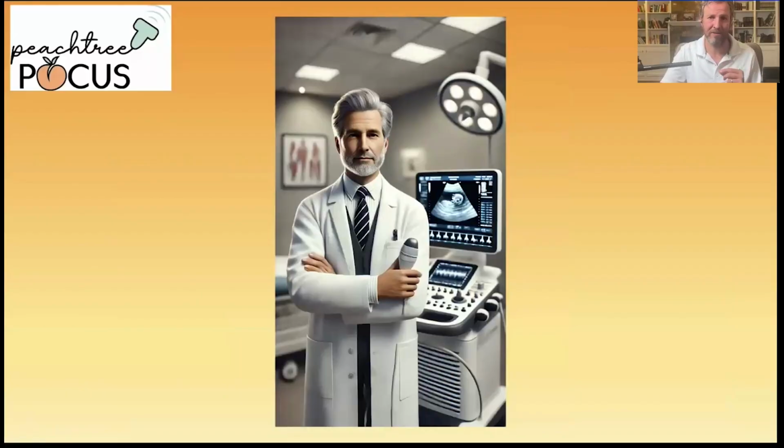And experience matters. This isn't the time for someone's very first ultrasound. You need a clinician who's already comfortable because the scans have to be both fast and accurate. For example, where I work, I have residents running the code typically, as I work in an academic center. If that's the case, I'll often step in as the sonologist as I'm typically the most experienced person in the room.